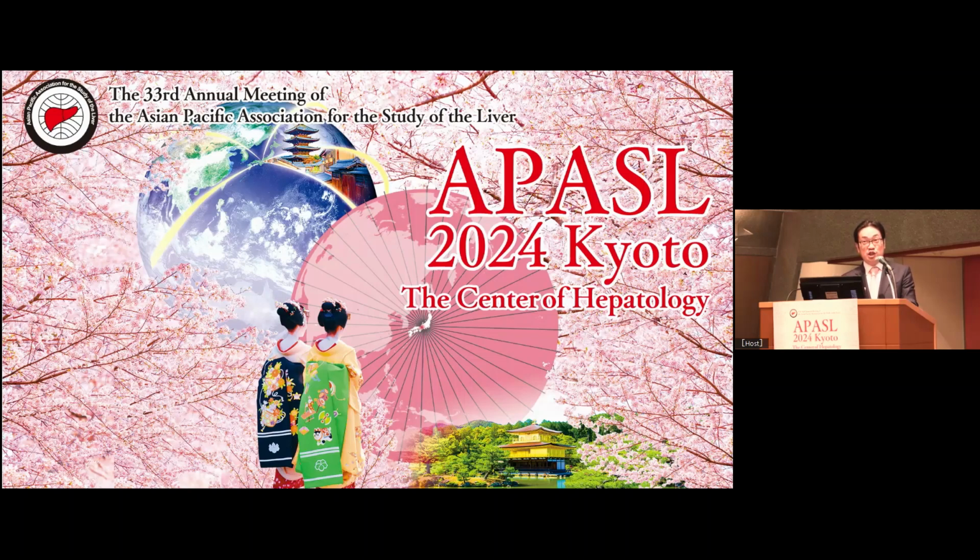But in Japan, they do liver biopsy and they do ablation, so they don't have to ask other doctors. So in Japan, still all the procedures are performed by hepatologists, not endosonographers. But if there is an advantage of EUS guided hepatologic procedures, then we can change in the future.